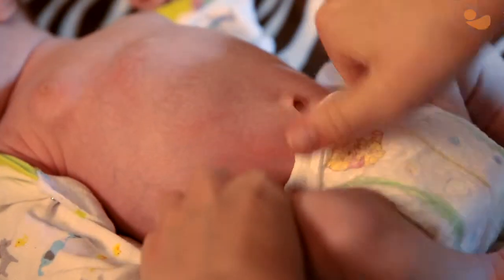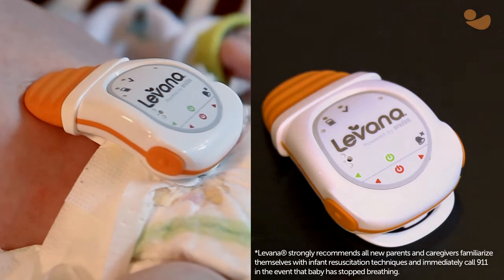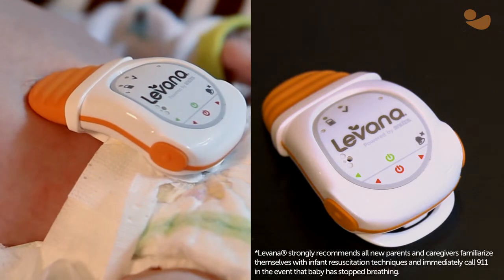OMA movement monitors clip to the diaper and monitor your baby's tiniest abdominal movements with a soft and flexible sensor tip. If the sensor detects more than 15 seconds of complete stillness, OMA will beep loudly to alert you that your attention is required immediately.